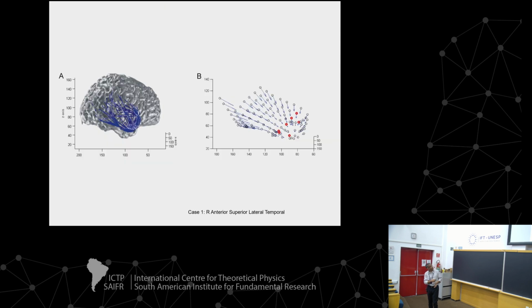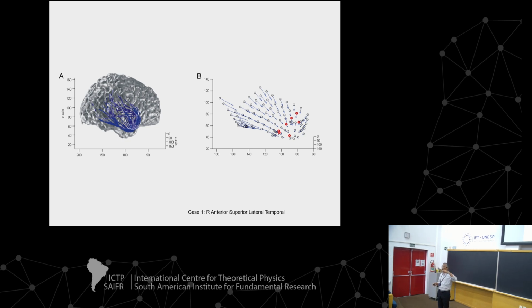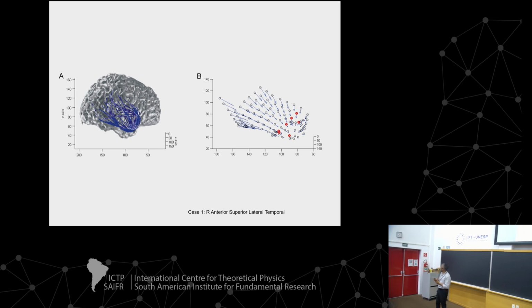So if you were to show it on the brain, and then just as the vector from each starting point, the length of the vector shows how far you traveled before you stop, they're all pointing to this part. So that was interesting. This is, in my mind, a signature left over from the epilepsy process that's showing up in the ongoing interictal background activity.